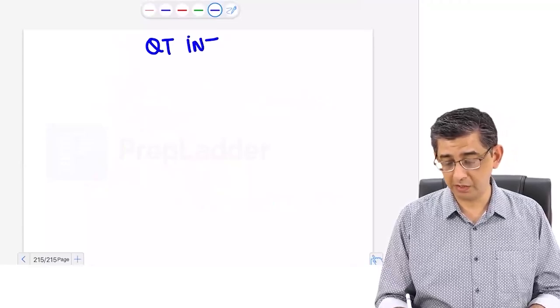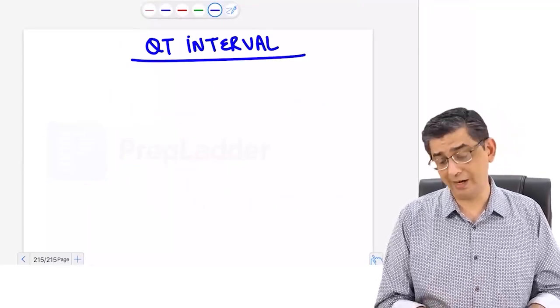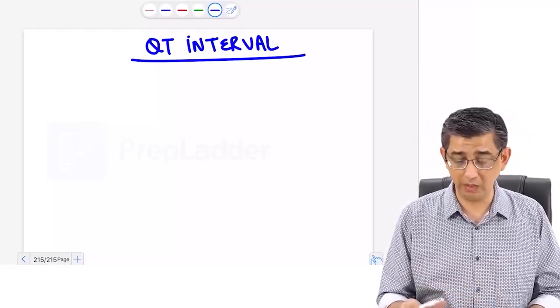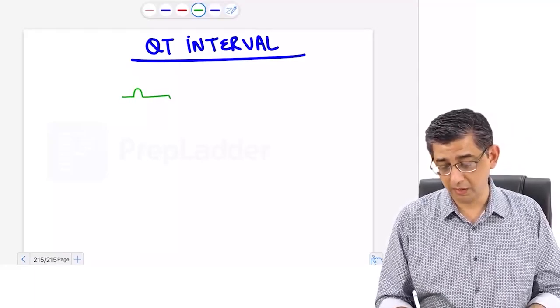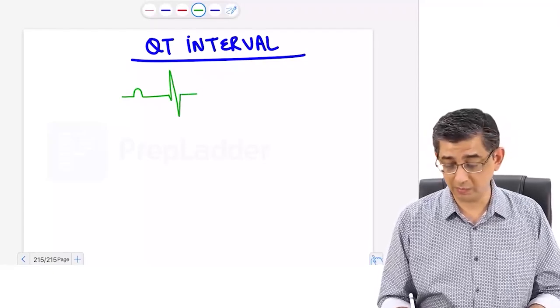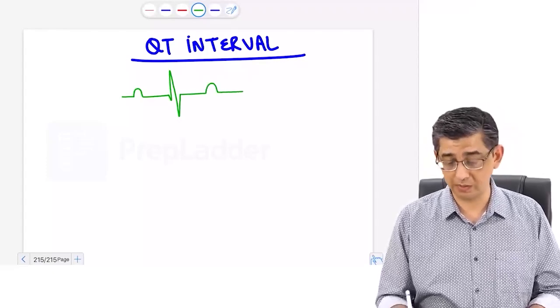And while I'm writing it, I straight wanna say that QT interval will always exhibit an inverse relation with calcium and magnesium. That's one of the important aspects that is usually asked in the exam with respect to QT. And what is the normal QT interval? I have already explained right in the starting of the discussion in ECG and Arrhythmias part 1 that normal QT interval will be 9 to 11 small squares.